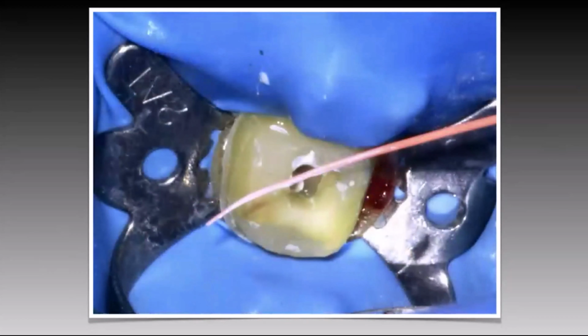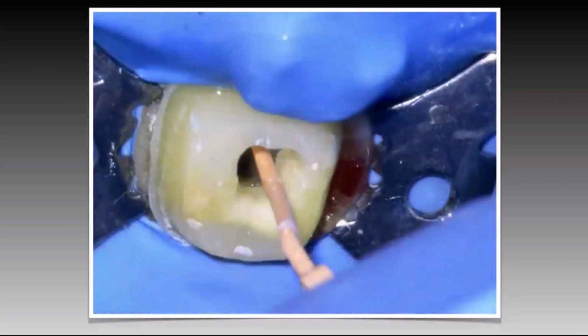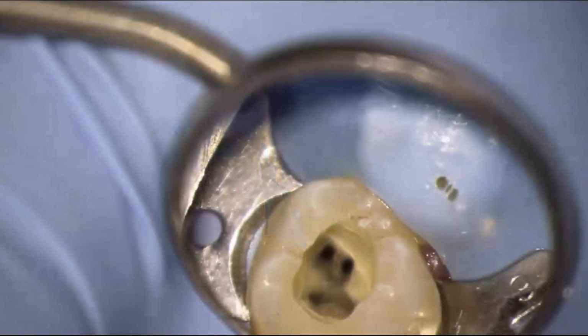And this is what it looks like. You take it out, you should see sealer uniform along the entire surface of that gutta percha point. So you take it out, and then you put a little bit more sealer. So here we are re-injecting a little bit more sealer, and then you place your master cone, you pack it, and then you immediately seat your backfill device and backfill. Okay, and that's the technique. And it works really well to move that gutta percha and that sealer into all the nooks and crannies and branches of the root canal system. So I'll show you a video of an obturation that I did.